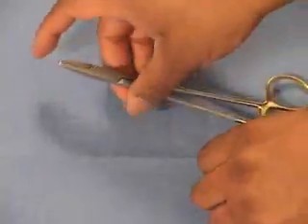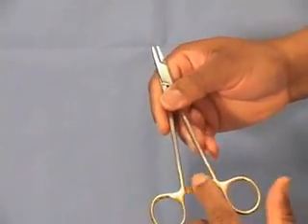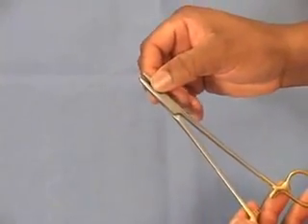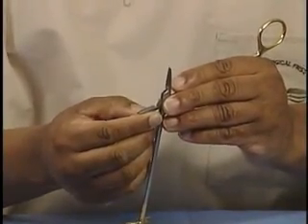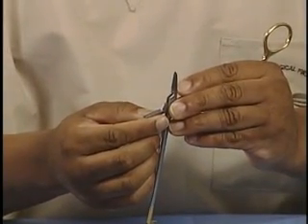Let's start by examining the needle holder. This is a ringed instrument. You'll notice that there are two rings in back, a ratchet, the shaft or body of the needle holder, the hinge, and then the jaws of the needle holder. If you look inside the jaws, you'll notice that there are serrations. This gives us better control over suture material and also various types of needles.